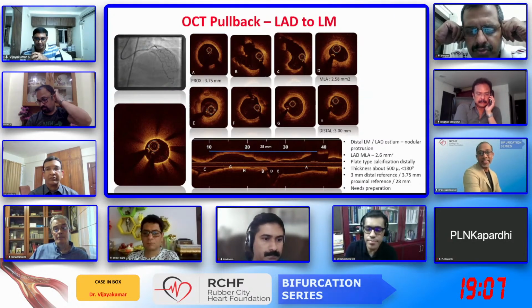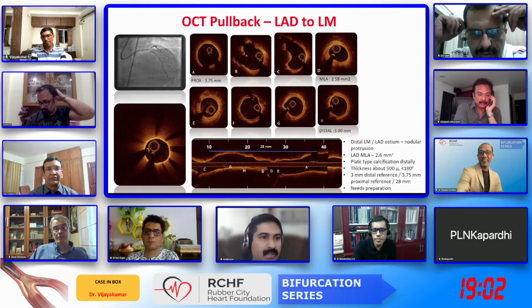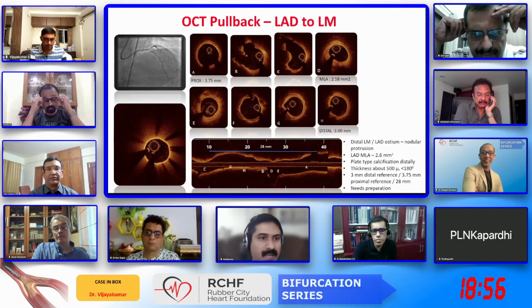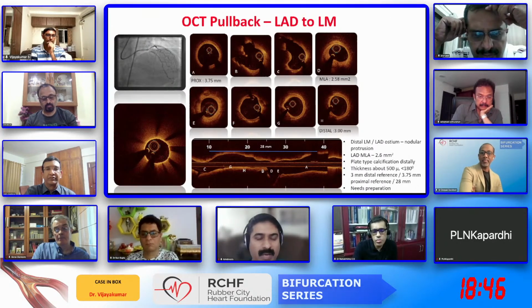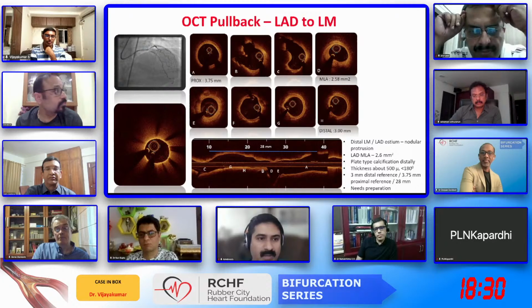Dr. Tom Devasya as well as Dr. Ramakrishnan have joined us. Hi, Tom here. Great case. I have had some discussion with Japanese operators, and like Dr. Vijay Kumar said, one effective strategy they use, if the circ ostium has heavy calcium which does not allow easy passage of a scoring balloon, is to go ahead with the rota there. Instead of passing the rota, they just sit at the circ ostium and kiss it in and around for a longer duration, so that the chances of the calcium nodule getting ablated are higher. That works out to be a good strategy.